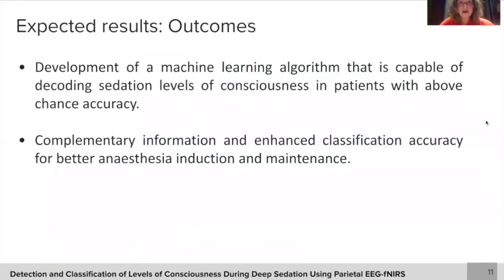And with this, we expect to develop a machine learning algorithm that is capable of decoding sedation levels of consciousness in patients with above-chance accuracy. And with this, to be able to give complementary information and enhance classification accuracy for better anesthesia induction and maintenance, and not have all the other problems of the under or overdose of anesthesia.